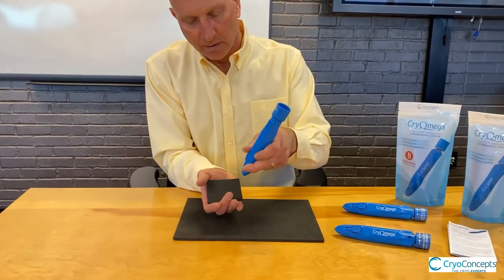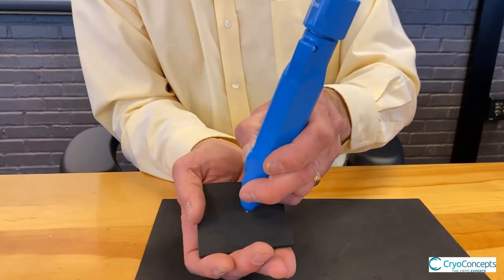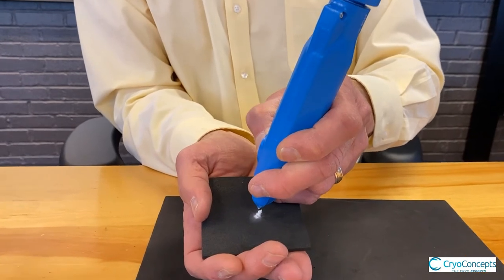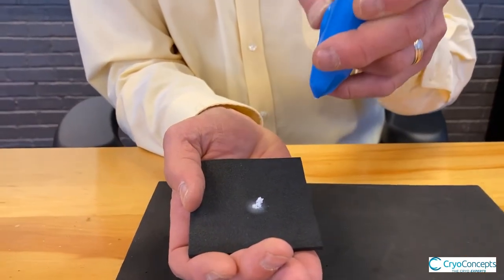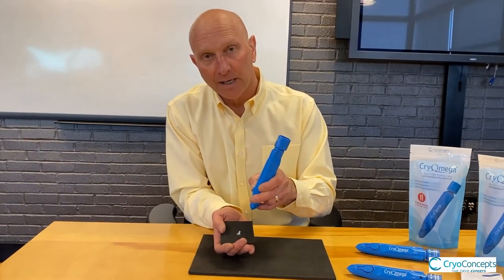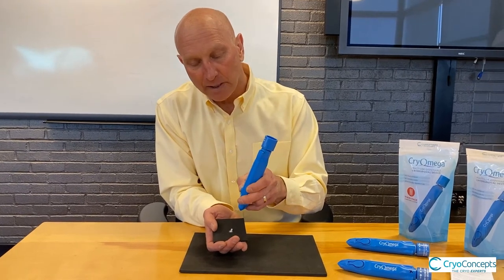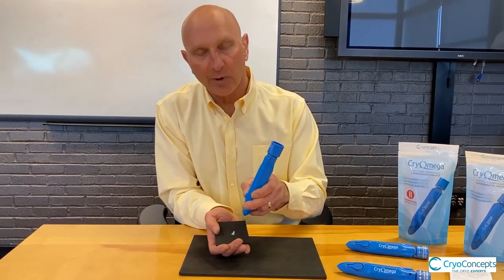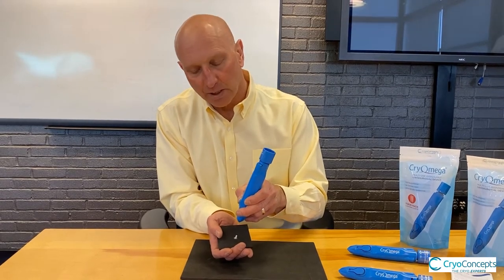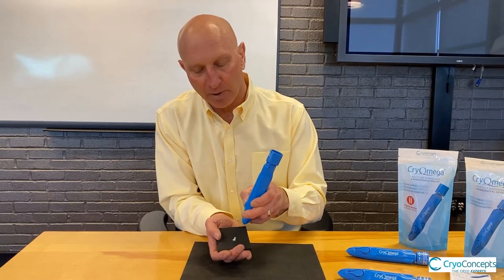To treat, you simply place it about a quarter inch away. The spray times are going to be anywhere from 5 to 40 seconds. Best practice in performing cryosurgery is to do multiple freeze-thaws, especially with something that's thickened, such as a common wart or a plantar wart, where you may even want to use a scalpel to take away some of the thickened area before freezing it, after pinpoint bleeding.